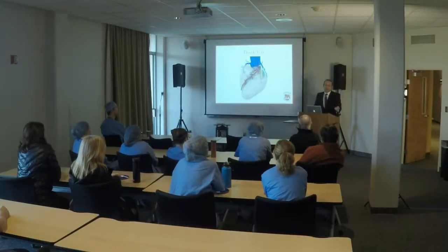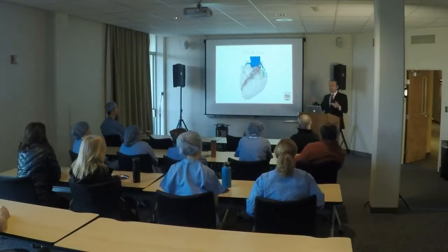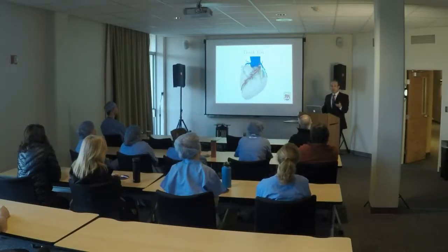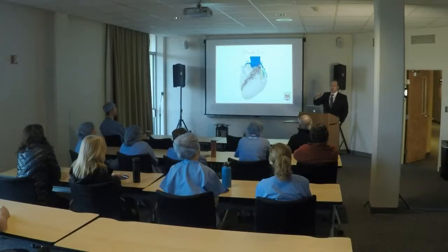We'll interpret the CT the same day of the acquisition. And then at that point, because we don't really know if they need the FFR CT till we take a look at the CT scan. So at the same day of the acquisition, we'll interpret the CT, and if there's an intermediate lesion, then we'll send it for FFR CT analysis at that point. They've really come a long way as far as turnaround time. When we started, it was much longer, but now it's like a few hours in getting the FFR CT analysis back. And then there are various ways to interpret it.